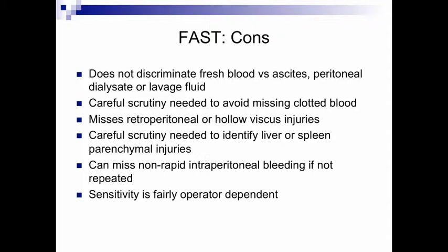And then even in the case of moderate or small intraparenchymal hematomas in the liver or spleen, in the hands of non-experienced operators, those injuries may be missed because they may not discriminate the complex echotexture of a liver hematoma from normal liver parenchyma or spleen parenchyma.